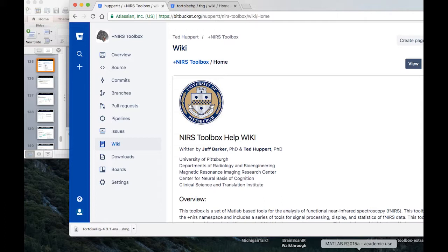I realized that the methods that people really wanted were not the way that we had coded up Homer. In fact, to answer that question properly, to make the image that my co-investigators wanted, really meant going back to almost square one. I'm sorry, Thomas, I started without you. In order to answer that question, I had to propagate all the information, all the noise, all the uncertainty through the model, so that I had enough information at the end to properly address that question. And the tools in Homer were not designed with that in mind.